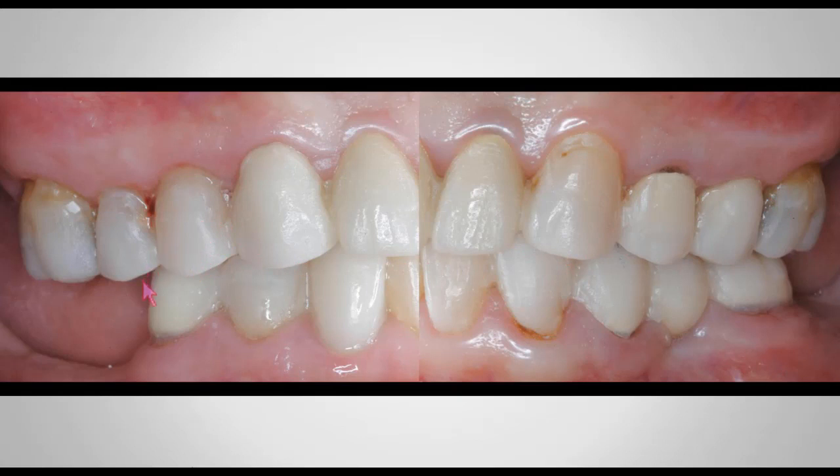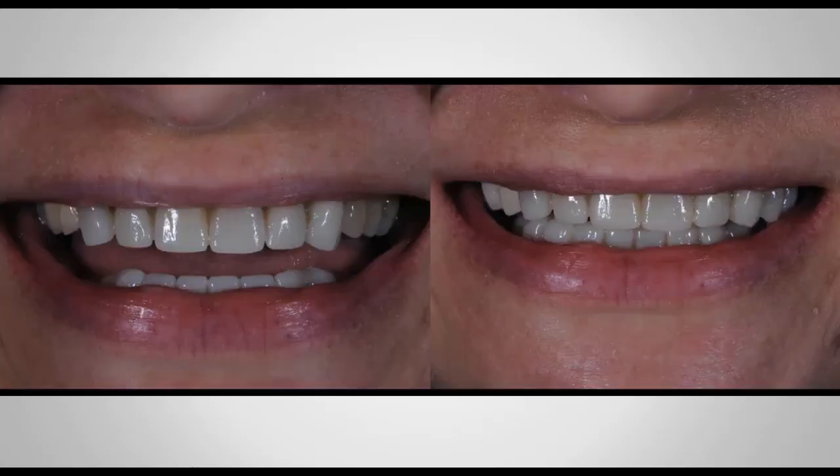So now I'm going to add the flowable composite to the posterior teeth and make sure that all the teeth now come into contact. There's maximum intercuspation at the same time that the condyles are fully seated, braced in their centric relation position. And this is immediately after all the rest of the prototypes were done. Look how much volume I was able to add to the smile. You can see a lot more teeth. This is more aesthetically pleasant. She's used to the new incisal edge position now.